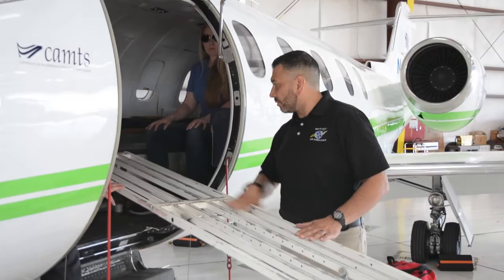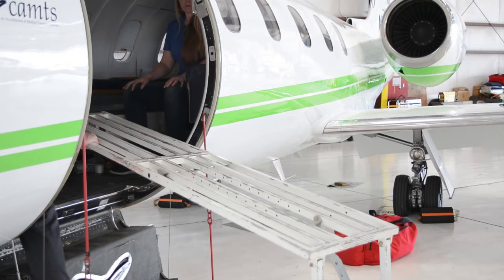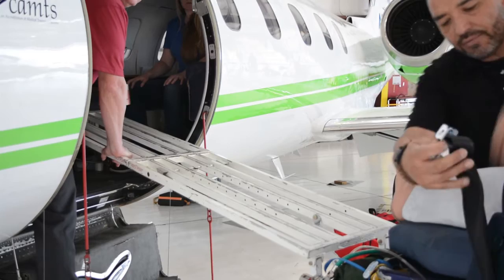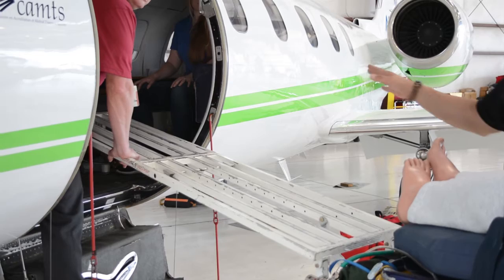The other thing you want to always make sure is that there's a little locking mechanism here. In order for it to accommodate, you want to make sure that this is down so that the patient can come all the way up. So that is down, this is ready to go. So now we're bringing the patient to the ramp. Again, we're just going to make sure that we're taking all of our gurney belts off, getting everything appropriately ready. The patient is on oxygen, so we're going to make sure that we have oxygen available on the aircraft.